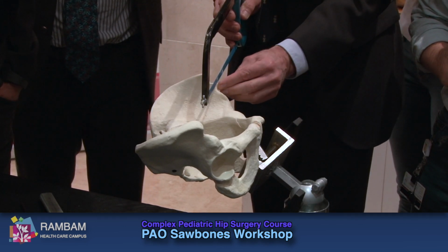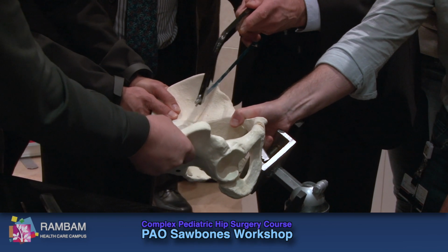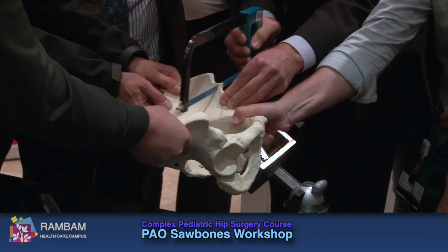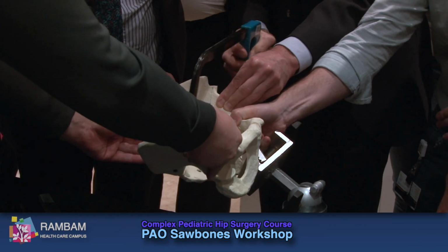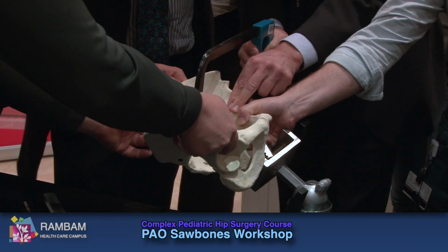Our starting point is going to be down here. It's not directly vertical like this, and sometimes it's quite sharp into the bone. Normally you cut it like this first to get a starting point. That's the angle I'm going to use, and straight down to the point. Retract it in here, retract it down here. Look at a small window here.